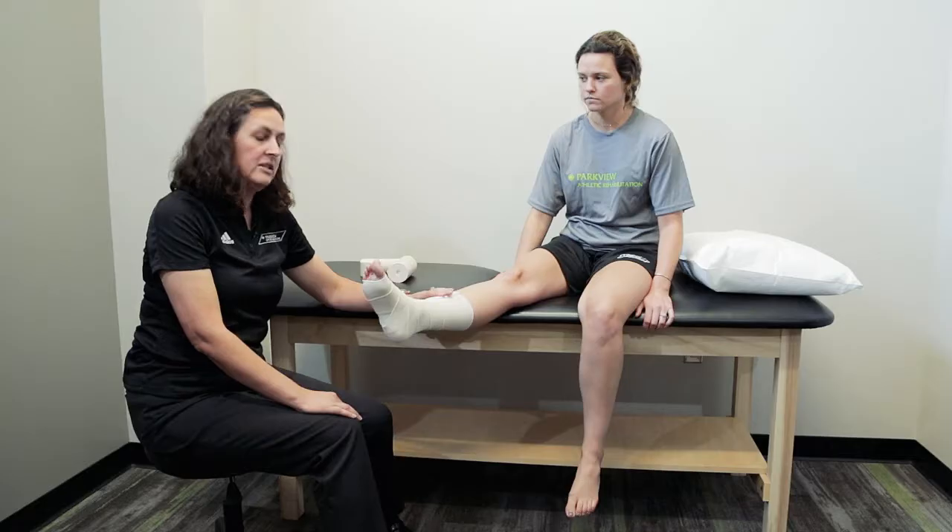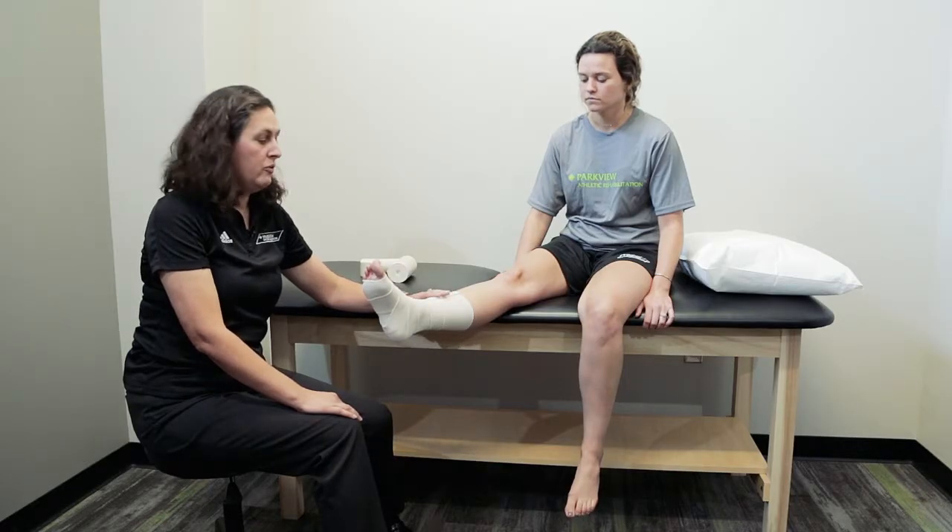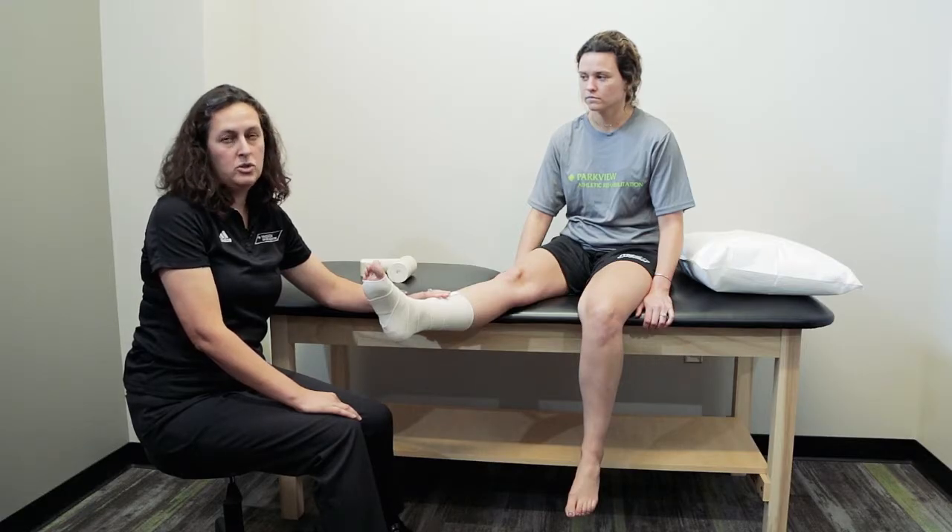You'll want to keep this on anytime you are not doing activity, and remove the compression wrap about two times a day to allow full motion of the body part.